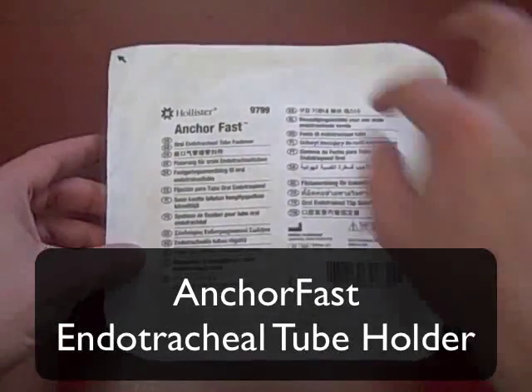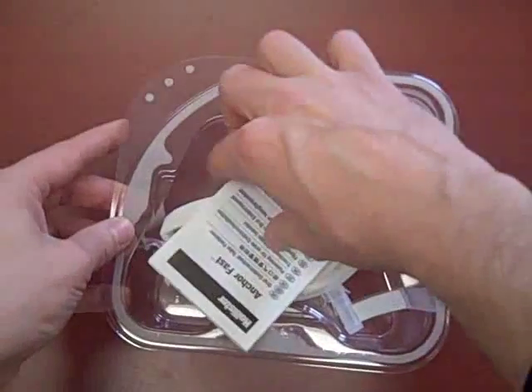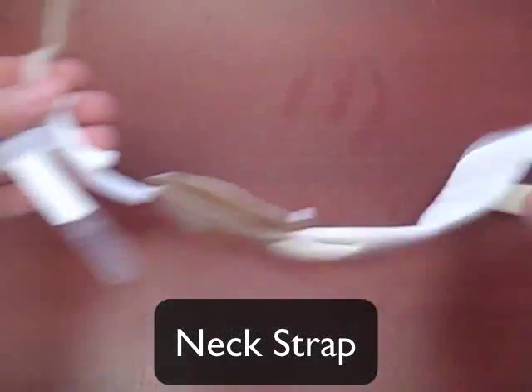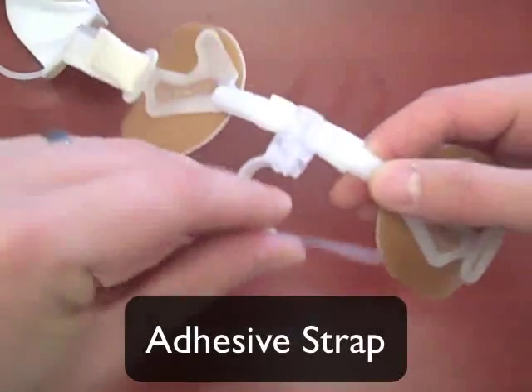This video is for the AnchorFast endotracheal tube holder. Inside the package is an instruction booklet and the tube holder. It has a soft neck strap as a safety feature, and it connects to the endotracheal tube with an adhesive strap.